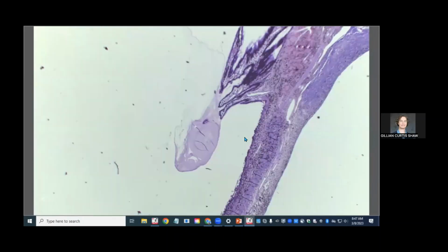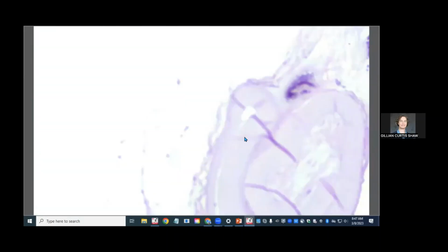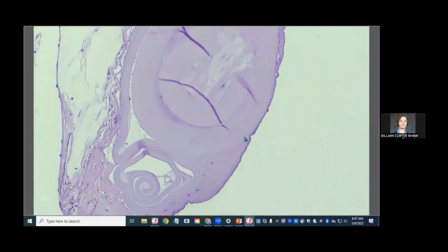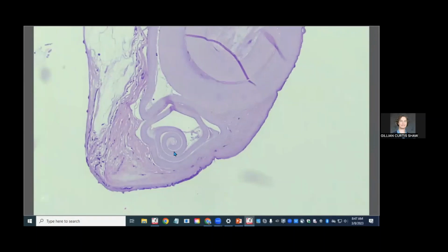So that's that. Let's look at the eosinophilic stuff in the posterior chamber. It is a snail. Excuse me, my voice seems to be going. It's not a snail. It looks like a snail.